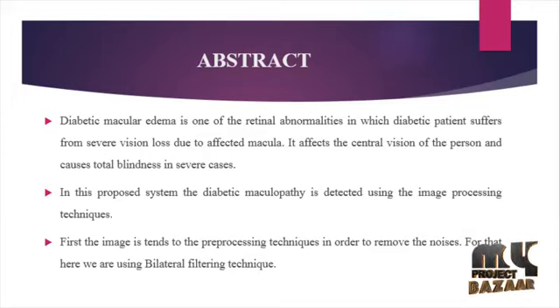Medical systems based on state-of-the-art image processing and pattern recognition techniques are very common nowadays. These systems are of prime interest to provide basic healthcare facilities to patients and to support the doctors. Diabetic macular edema is one of the retinal abnormalities in which diabetic patients suffer from severe vision loss due to affected macula. It affects the central vision of the person and causes total blindness in severe cases.